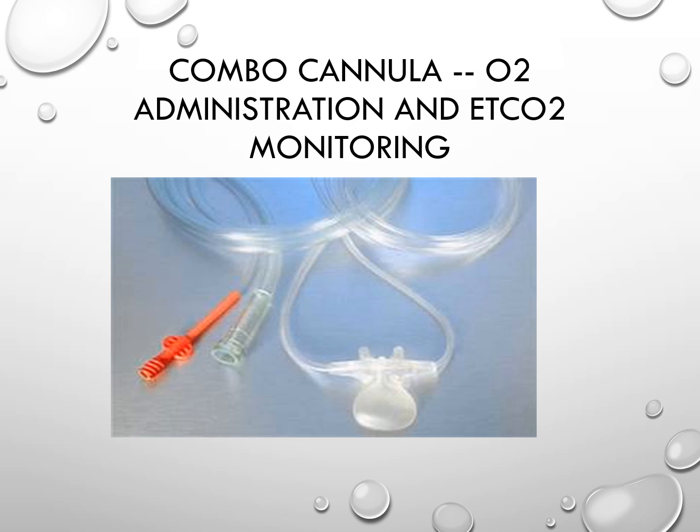The caveat here is if the oxygen flow is at about 5 liters or more per minute, it will render the accuracy of end-tidal readings not very reliable because the oxygen will be diluting the CO2 that's exhaled by the patient.